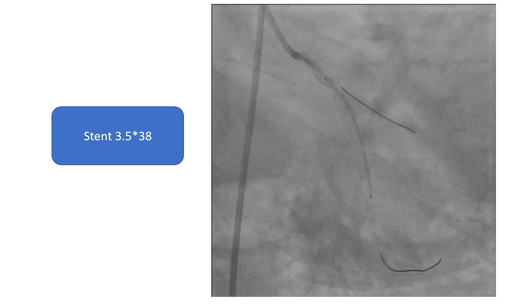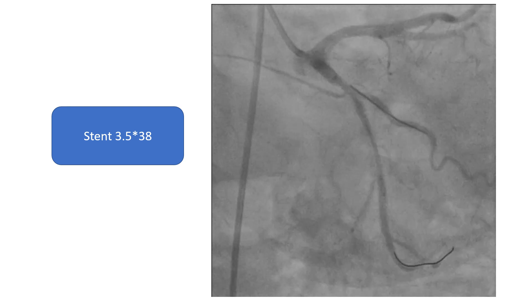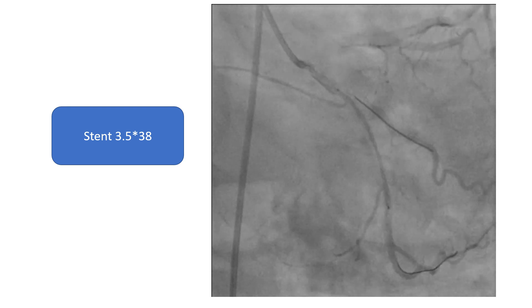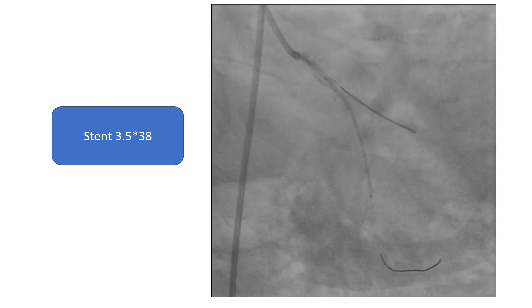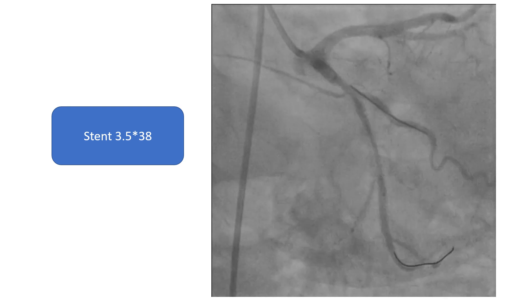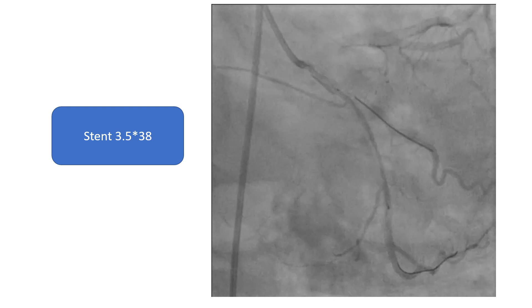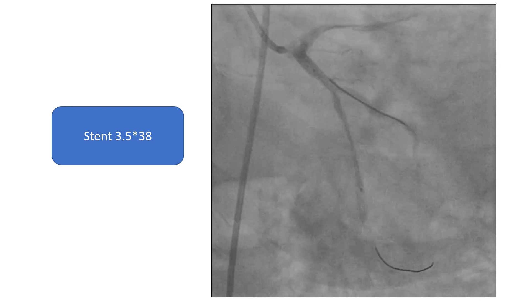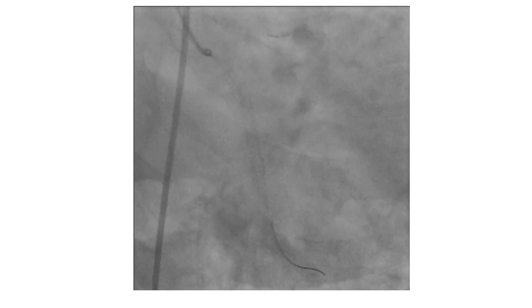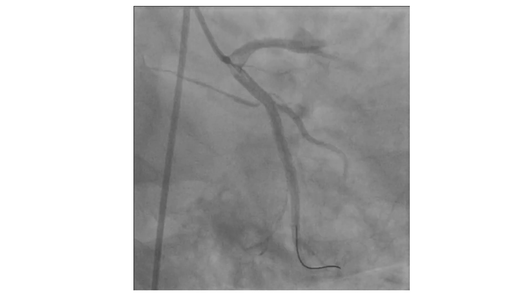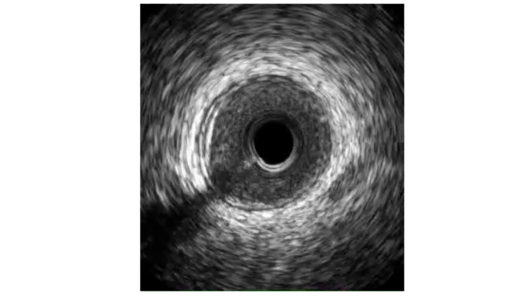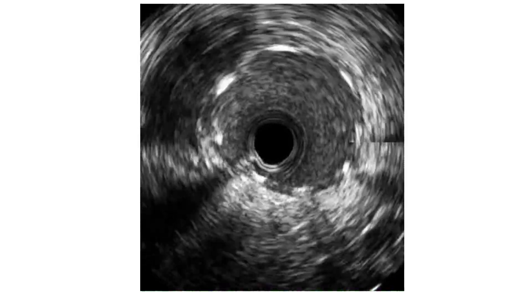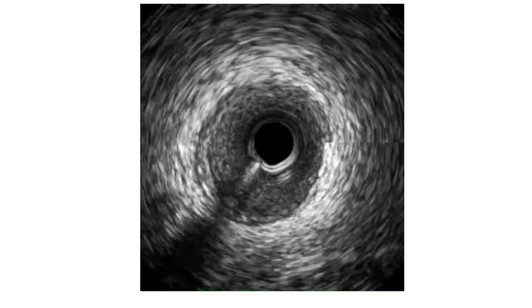So stenting was done. It is important to choose a long stent to cover both the proximal and distal ends, with a margin of at least 5 mm to prevent propagation of the hematoma. This was a 3.5 by 38 mm stent — the longest one available in the cath lab. Post-dilatation was performed and this is the final result. It is also important to assess the edges of the stent by IVUS; here we can see the distal edge completely covering the hematoma with no edge dissection.